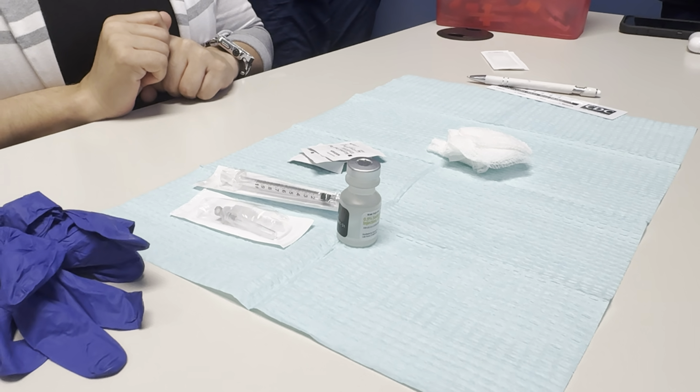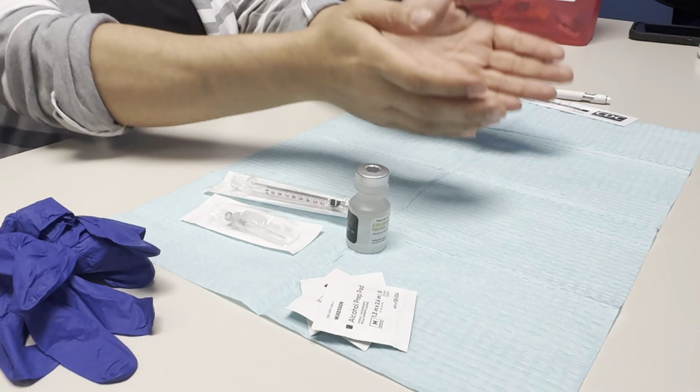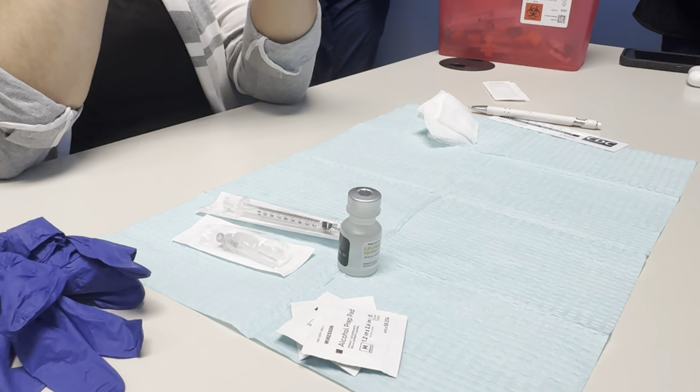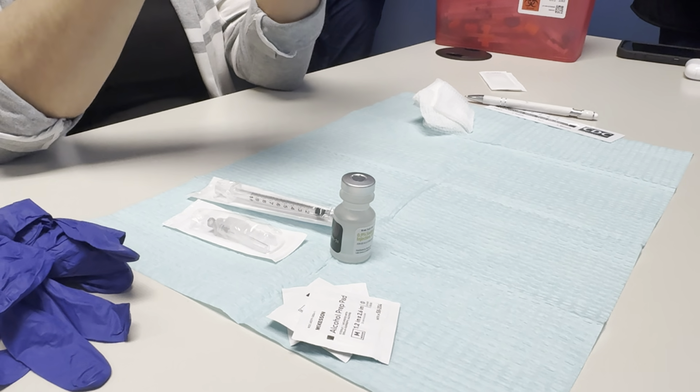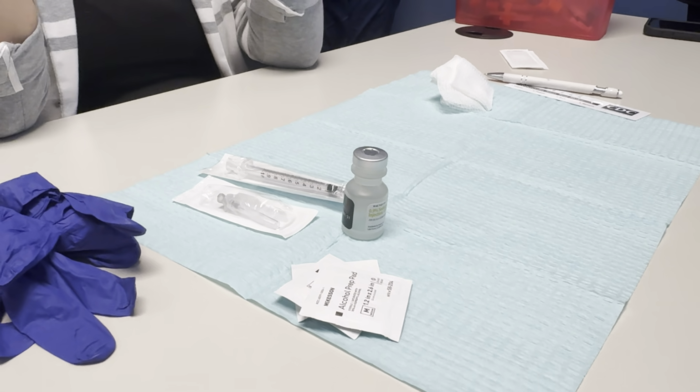Okay. All right, let's get started. She's going to come and we'll do it. Okay, go ahead and get started. First thing, remember, you're going to go through the patient rights. Every single time we do the patient rights. So this is the right patient, this is the right medication, this is the right date we're doing, and so on. All of the rights are done.